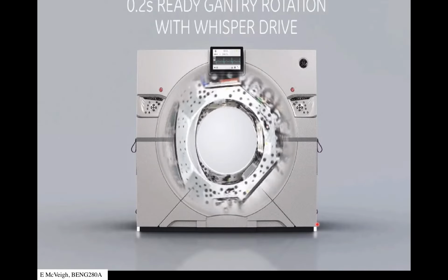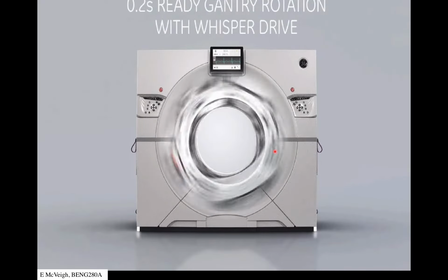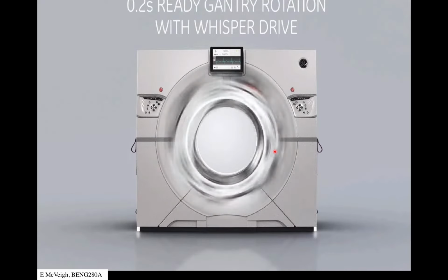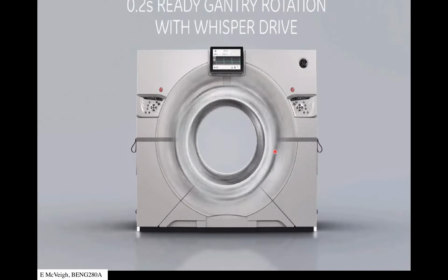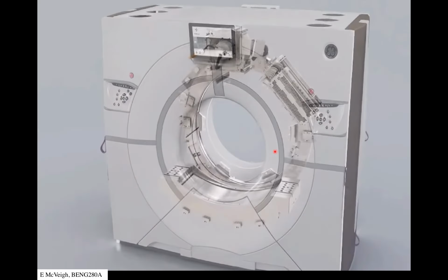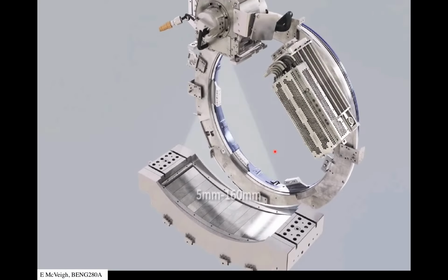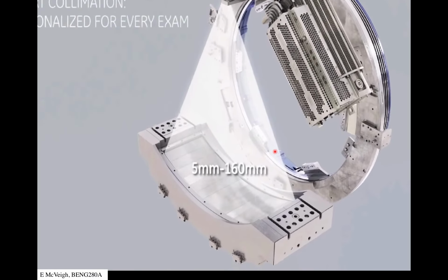I think I showed this at the introduction, but it's a nice graphic of how the detector and source rotate. It makes a bit of a noise, and now that the rotations are at a high frequency, the noise is sometimes a little alarming, so they've been trying to make these things rotate very quietly.